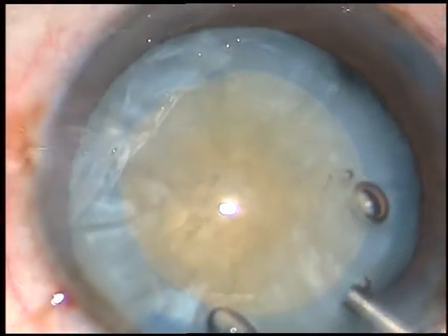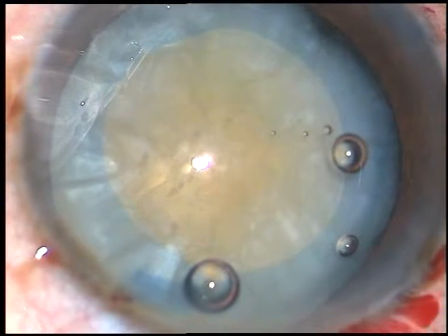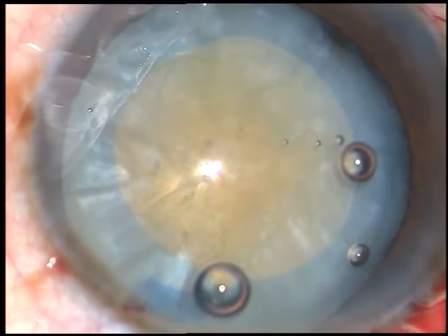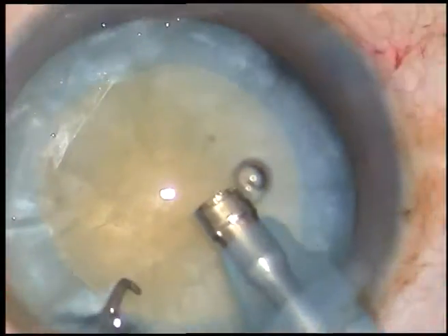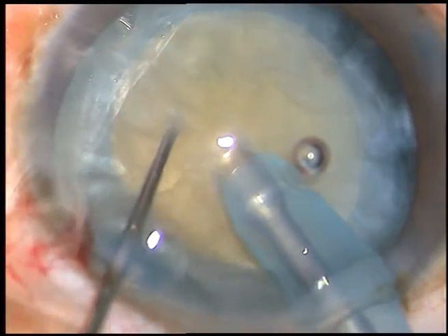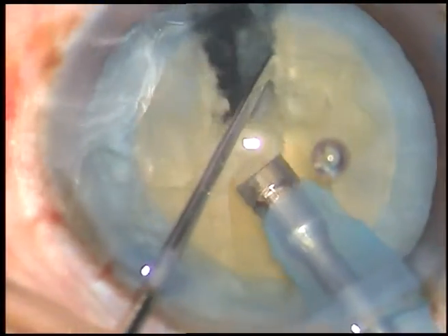That's it. And now, management of the nucleus. The tip of the phaco handpiece is introduced into the anterior chamber. This is an Oertli Cataract 3 phaco machine. Now, I bury the tip into the substance of the nucleus, hold the nucleus firmly and chop it.